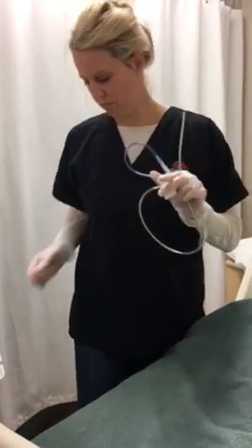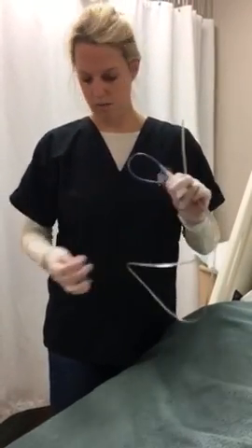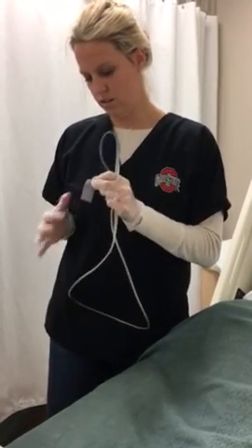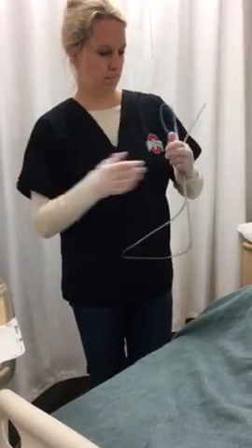Oops. Do you want to get 3 pieces of tape ready? Do we need to verbalize? And I also need a piece of tape for securing. Do we say each equipment piece, or just say here's my equipment? I really don't know.